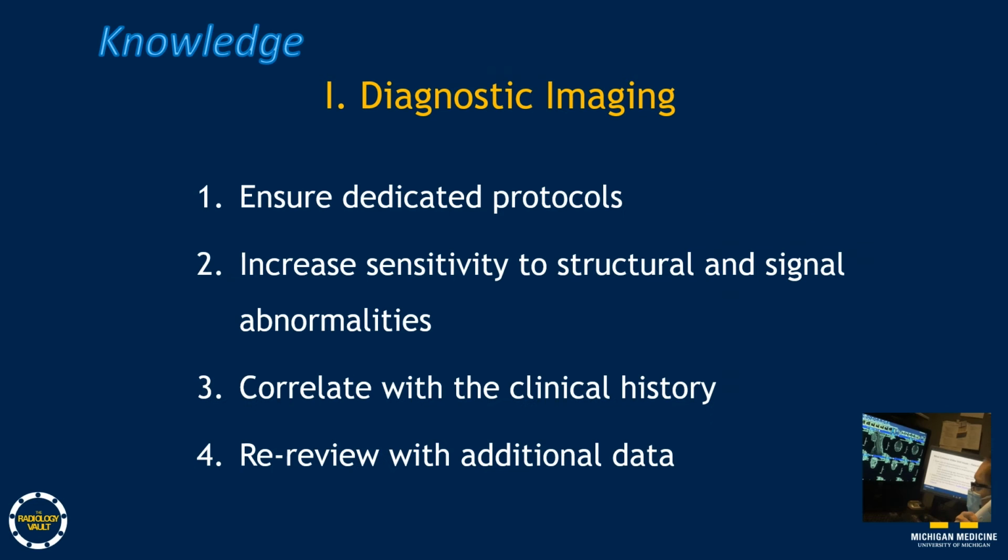Knowledge is a foundation. It is important for the neuroradiologist to ensure that diagnostic imaging is of the best quality and with the proper protocols. And to interpret these studies effectively, we need to have high sensitivity and experience to identify potential abnormalities, some of which are very subtle. We then have to correlate it with the clinical information. We often need to re-review the imaging once the clinical teams have provided all the data.